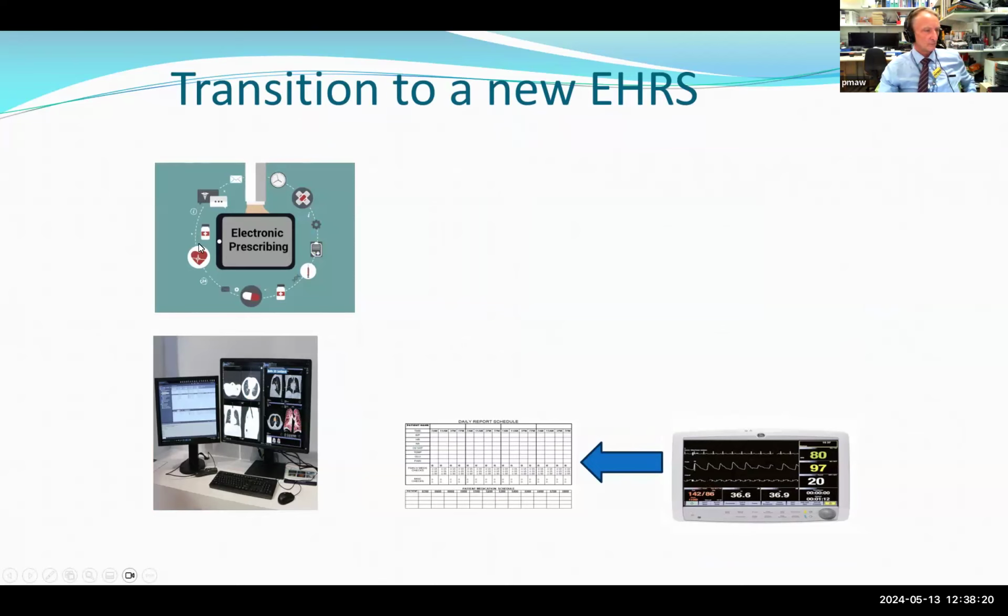We did have a separate electronic prescribing system. We've had a PACS system for quite some time now. And then we had the patient bedside monitors, and their readings were put onto paper charts. So then, come 2019, I think it was, we implemented our Epic system.